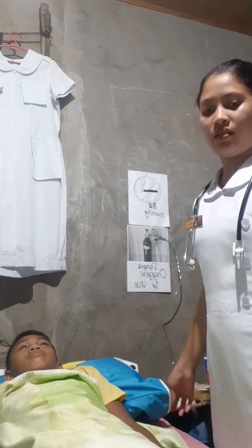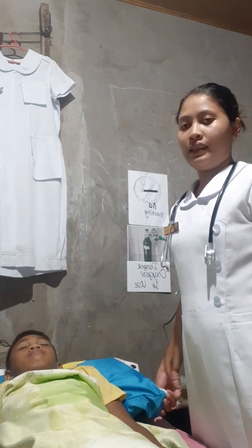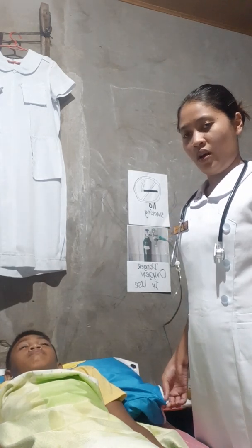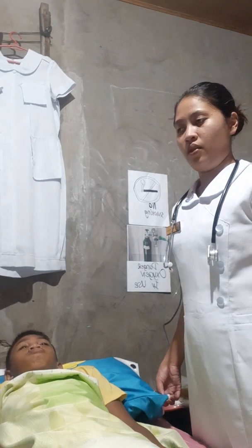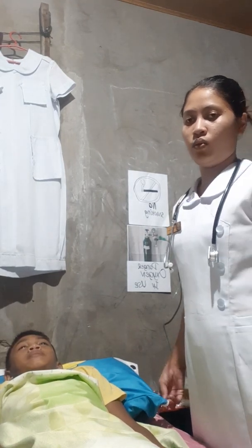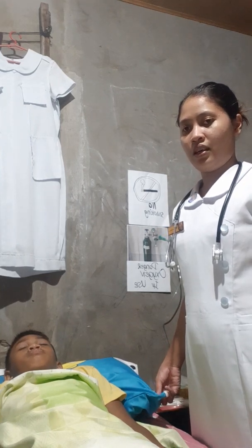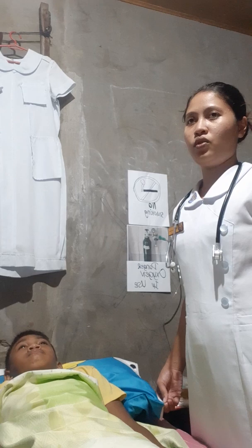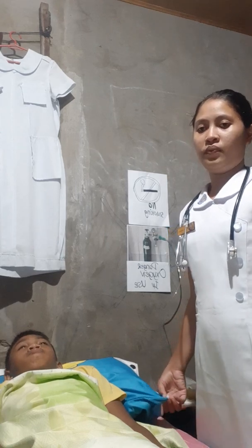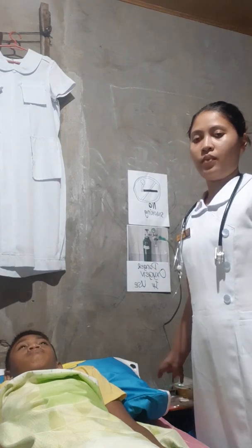Then next, perform hand hygiene and put on PPE if indicated. Afterwards, we are going to provide privacy by closing the curtain around the bed and close the door if possible. Then obtain all necessary materials at the bedside of the client to save time and effort.